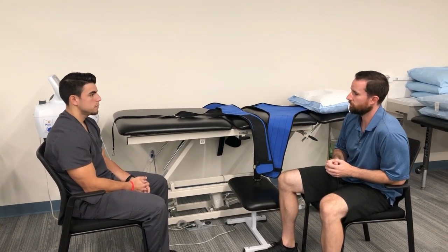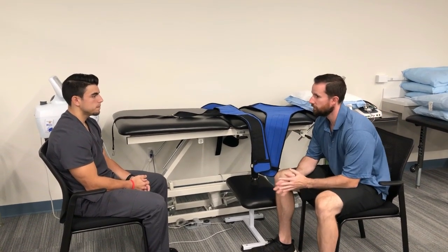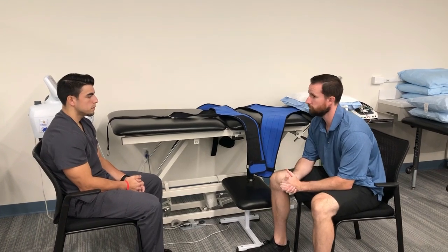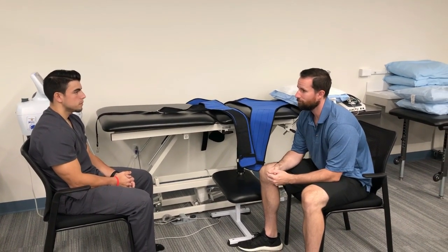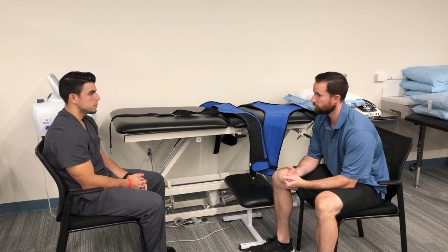So on a scale of 1 to 10, 10 being the worst, what would you say your pain level is today? Roughly 7. Okay. So you've got quite a bit of pain. So I think I want to start with the traction treatment first. So before we get started, I need to check to make sure you don't have any contraindications or precautions.